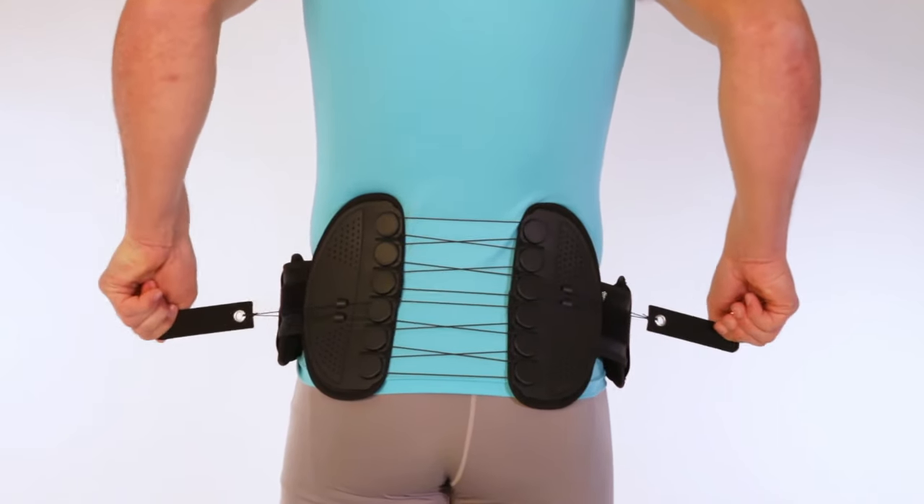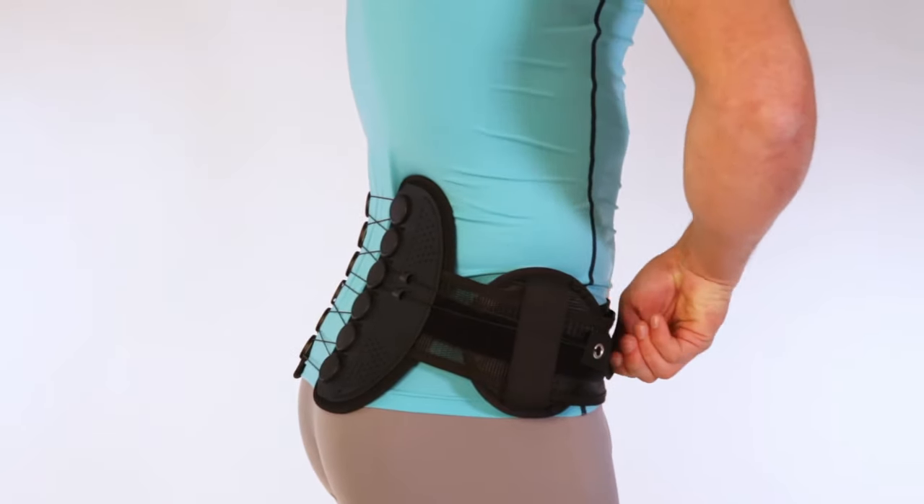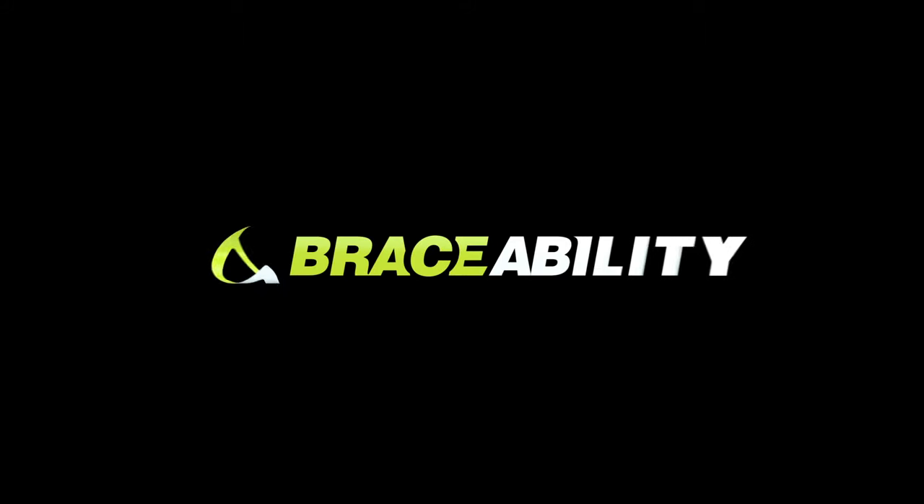Pull handles out from the body to reach desired compression, then attach to the front. If pressure pads feel uncomfortable, readjust or remove them. Braceability — we're on a mission to help you get back to life.